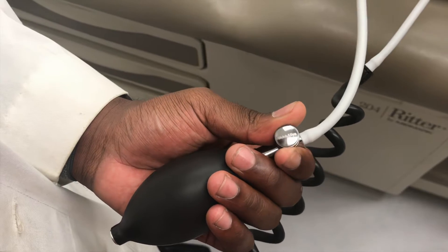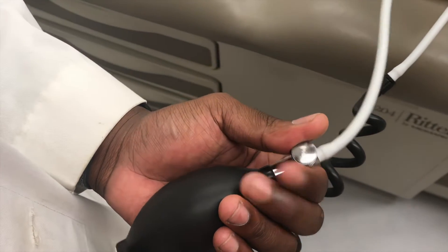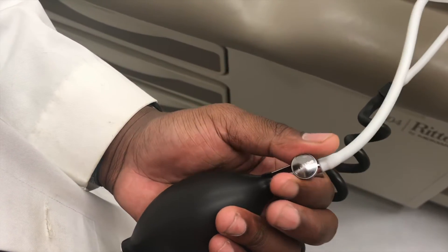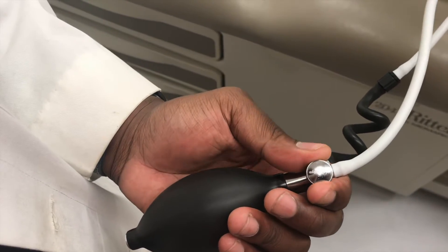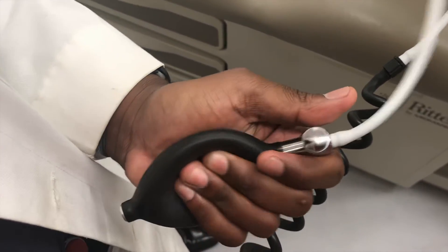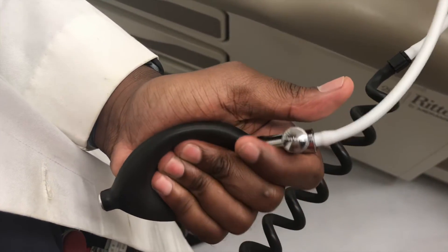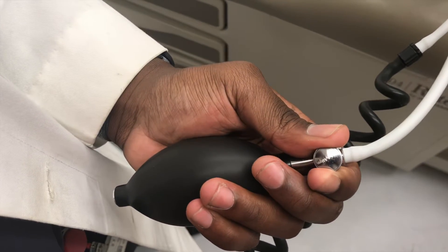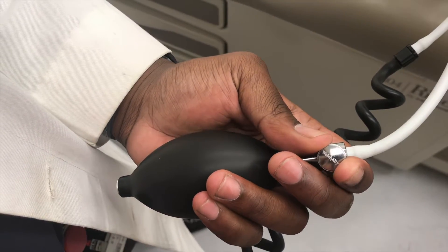Note here how the demonstrator holds the blood pressure pump so that he is able to manipulate the tightening knob with one hand. It may be helpful to pause. He begins by turning clockwise, all the way into the closed position, enabling him to inflate the cuff. After inflating, he turns the knob counterclockwise, which will allow the cuff to deflate.